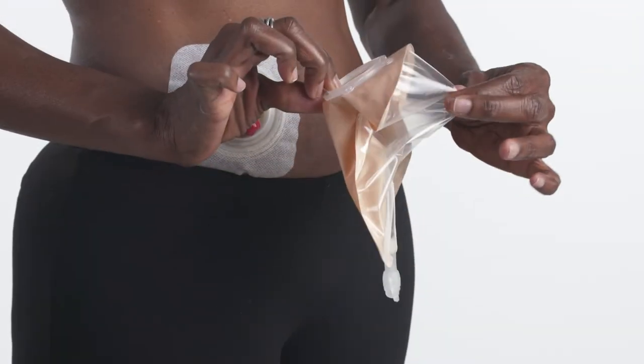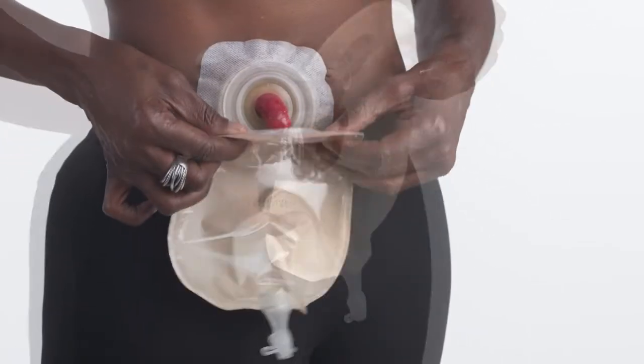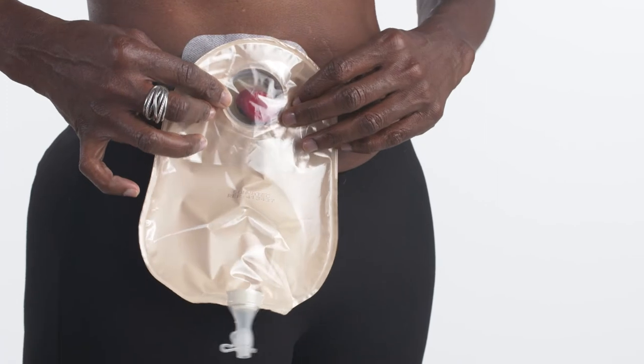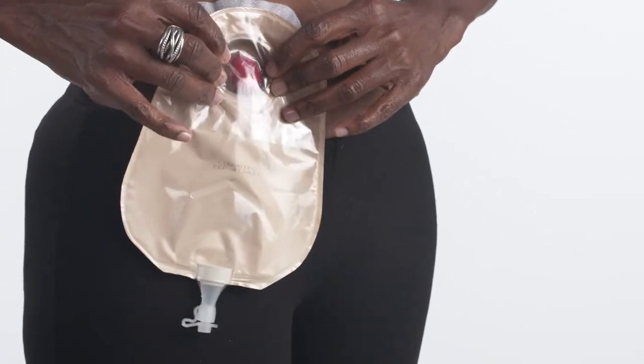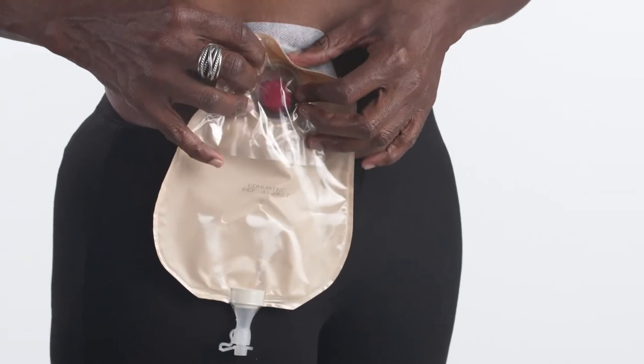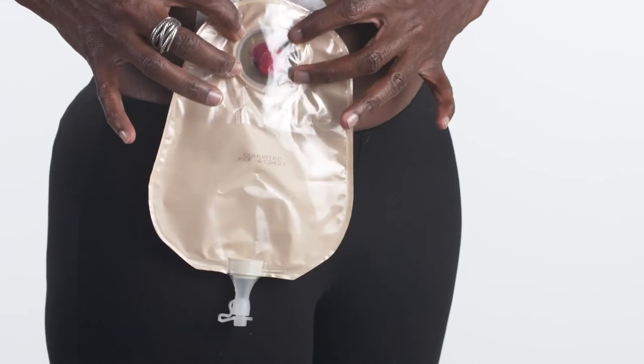Before applying the pouch, separate the sides of the pouch to allow some air to enter. Align the plastic ring, also known as the flange, on the pouch with the flange of the skin barrier. Press the two flanges together beginning at the bottom, working your way up to the top. Several clicks may be heard.